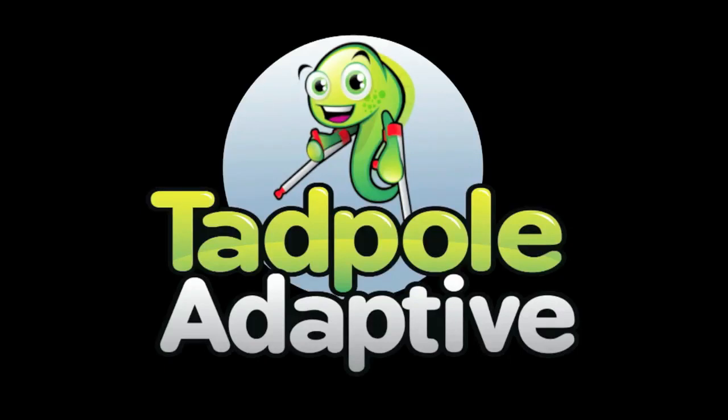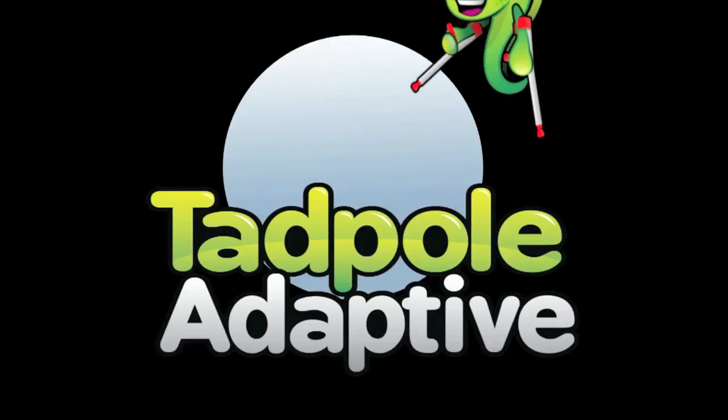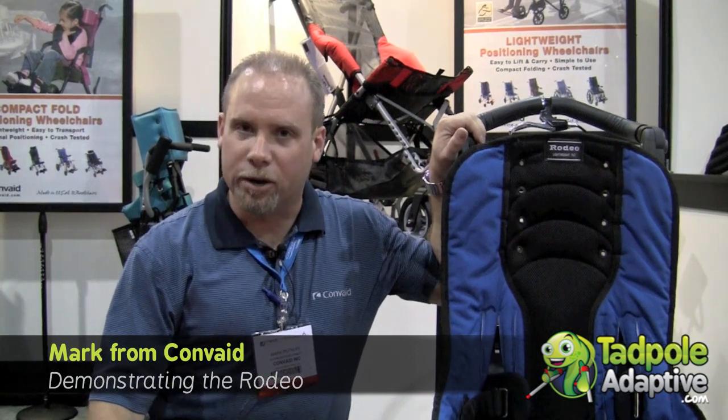The following is a Tadpole Adaptive production. Hey Tadpole Adaptive, it's Mark from Convaid again. I'm going to demonstrate our Convaid Rodeo.